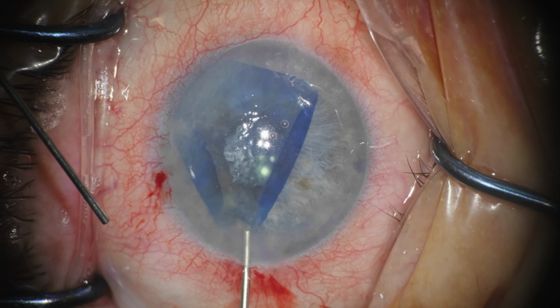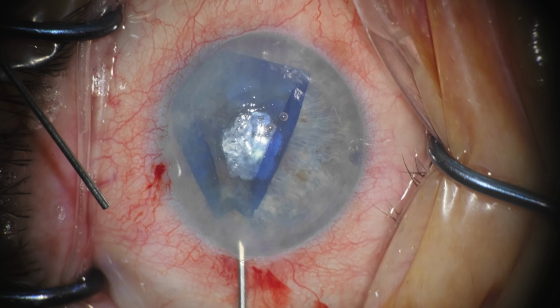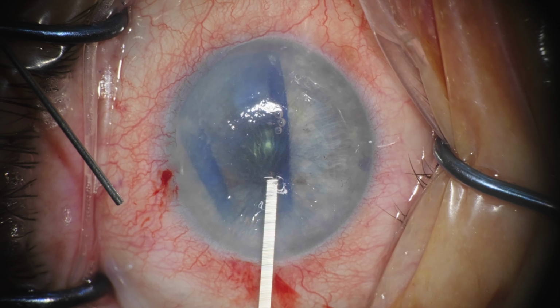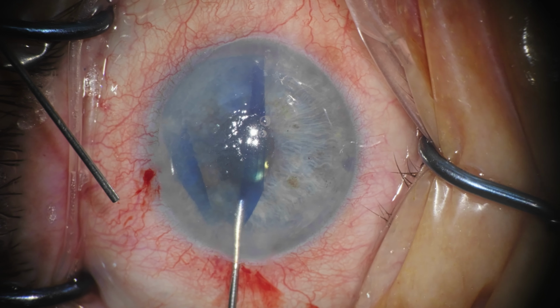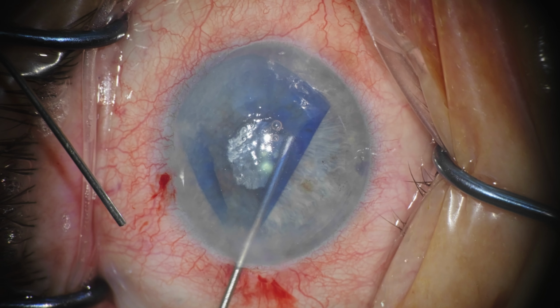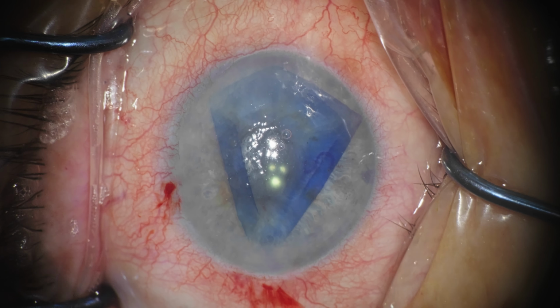We don't necessarily want to use a bubble on top of the graft because there's no real need for it at this time, because the graft has already unfolded a bit and will obey our maneuvers. And engaging the peripheral rolls, we get to position it dead center in the AC.